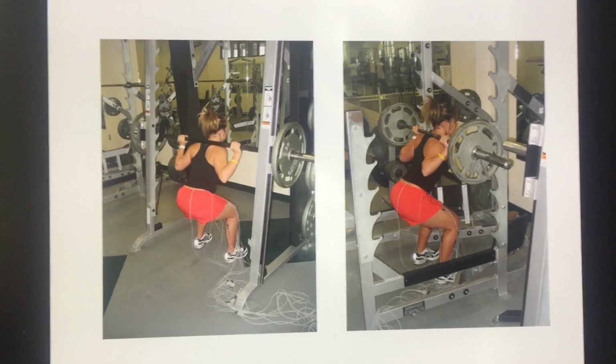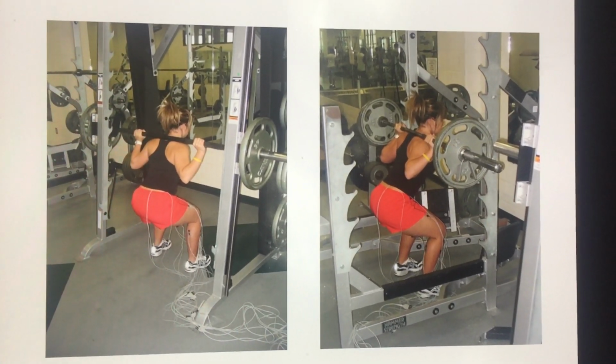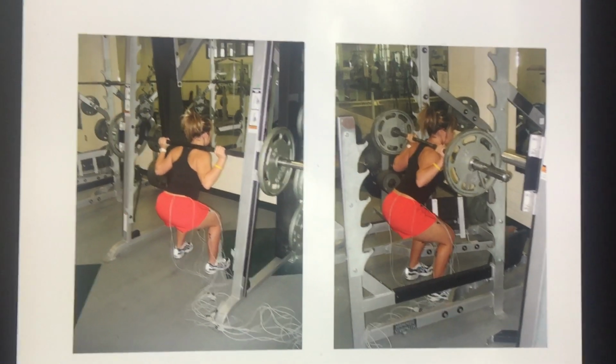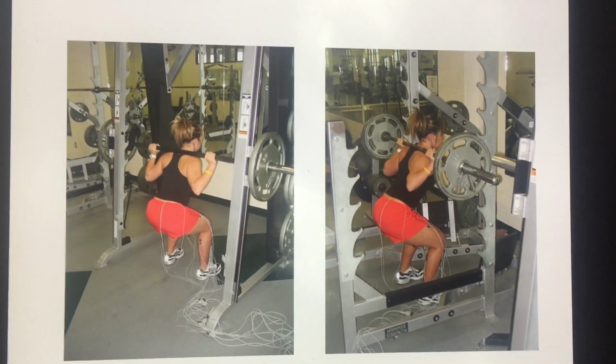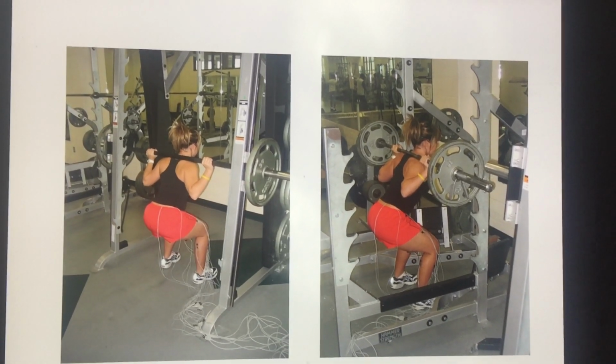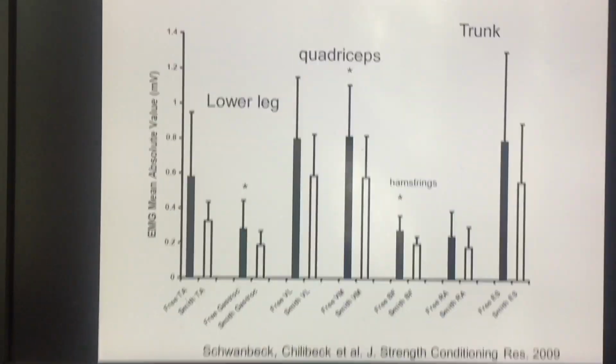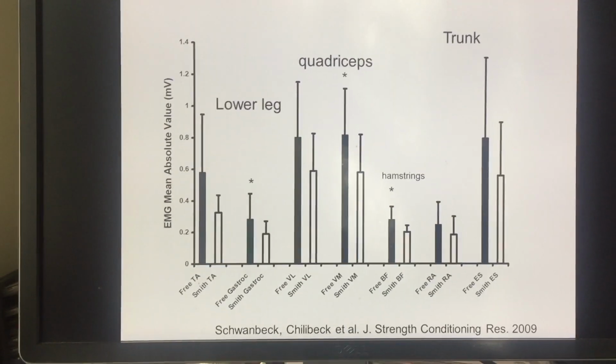So we did a study comparing, you can see the EMG electrodes. We got a lot of electrodes there. They're hooked up to a bunch of different muscle groups, and we assessed EMG activity in the trunk and the leg muscle groups during this type of exercise. And here is our results graph. So it's pretty busy, but I'm going to walk you through this.